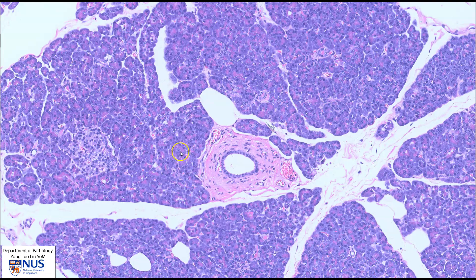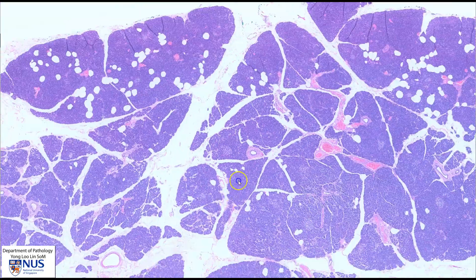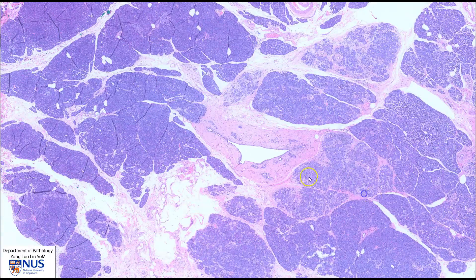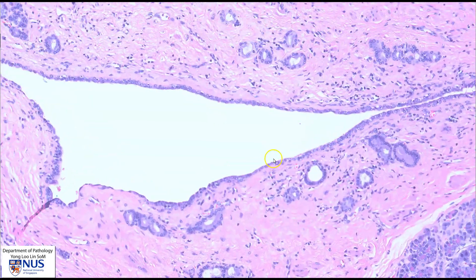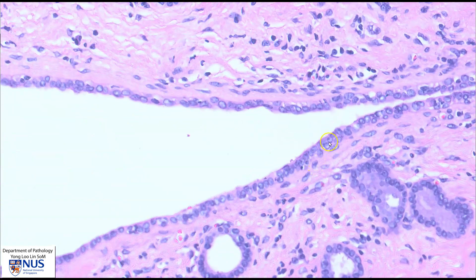The digestive enzymes are secreted into the pancreatic ductal system. We can see here a small duct, and these small ducts successively join up into larger ducts. For example, here we can see the pancreatic duct, which is lined by very uniform bland-appearing cuboidal to low columnar epithelium.